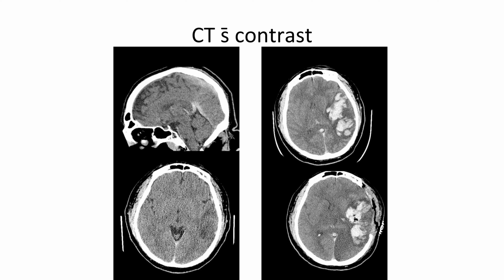So you can see on the right images, the straight sinus is still clotted with blood, and there's been a massive intraparenchymal hemorrhage. And in the bottom right is post-op after sucking away a lot of the blood to remove pressure. You can also see in the image at the bottom right, on the left side there's a bright little spot going into the patient's right lateral ventricle, that's an external ventricular drain, so that also is helping relieve pressure.